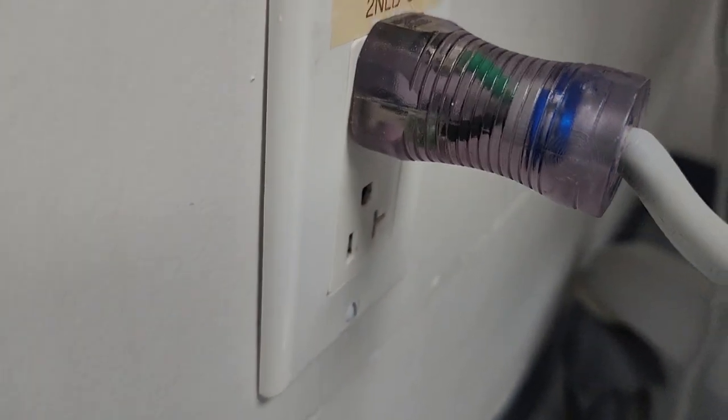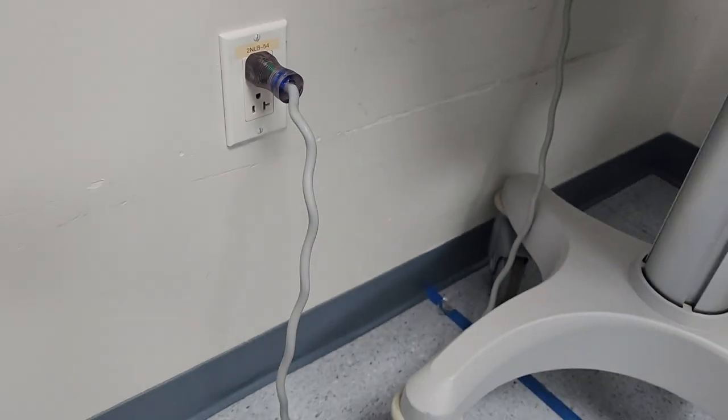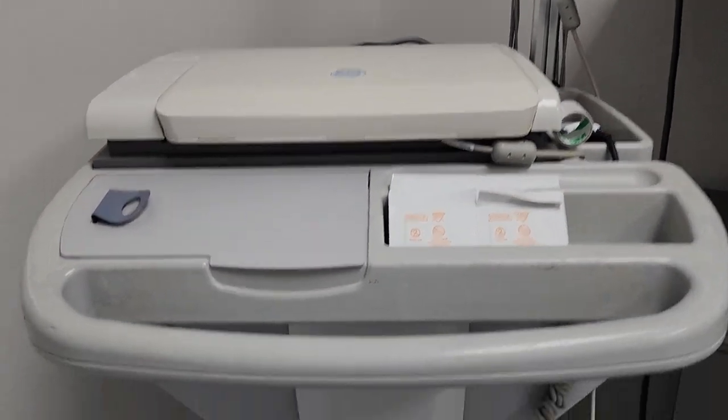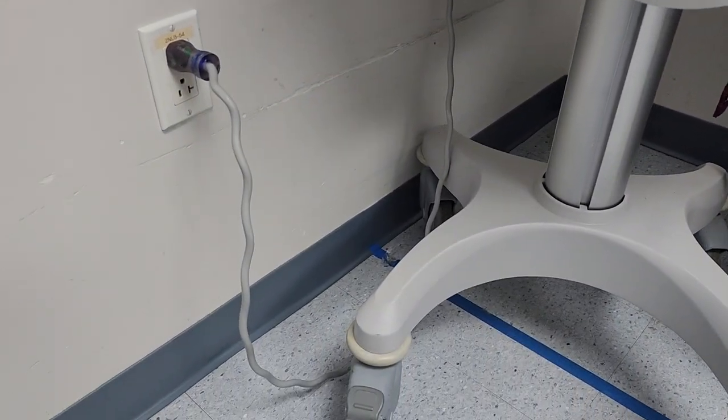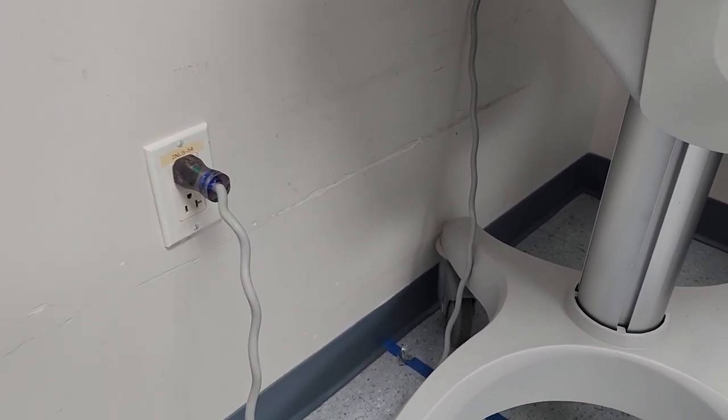And you can tell right here, just at that angle, this cord's already had kind of a hard life. Now, given this one is on a GE Mac 5500 — it is end of life — it's still perfectly serviceable, so there you go guys.